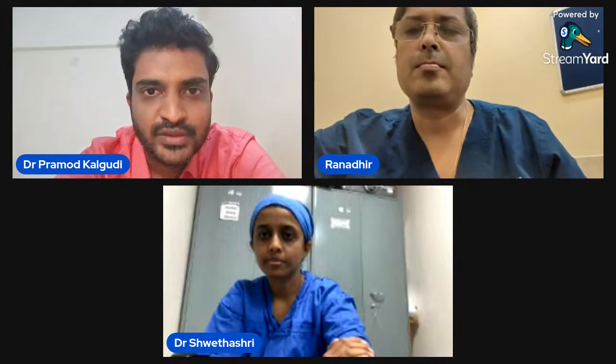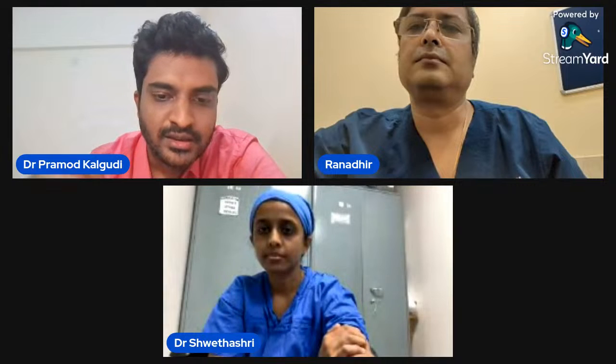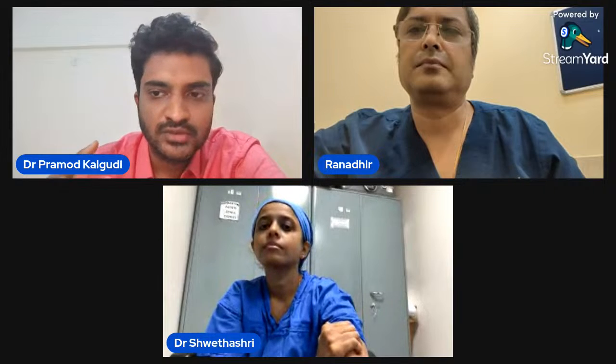But even when a patient doesn't require it, it takes hardly 5 to 10 minutes to scan a patient in an ICU. Most of the videos which I have shown are in a sitting position, wherein somebody is sitting and I'm doing it. But in an ideal scenario, it has to be in a lying down comfortable position with a headrest or a pillow, and the patient resting comfortably, because that makes a lot of difference. And in the ICU there are so many things around. You have a ventilator, you have a central line catheter, and so many things.